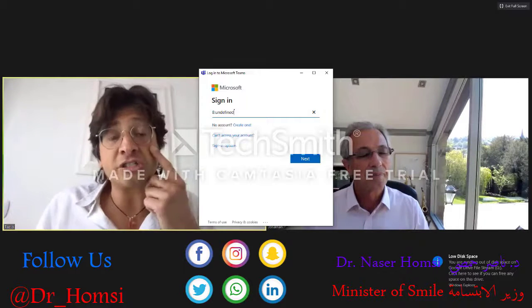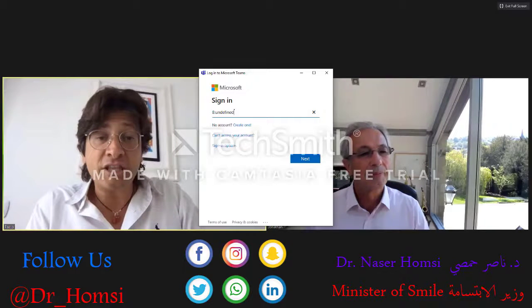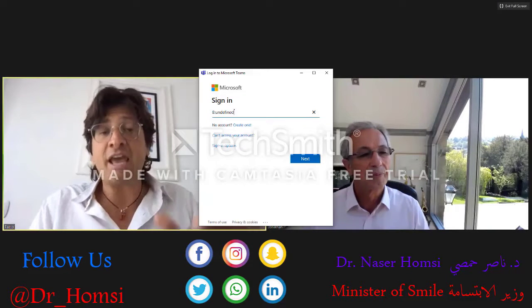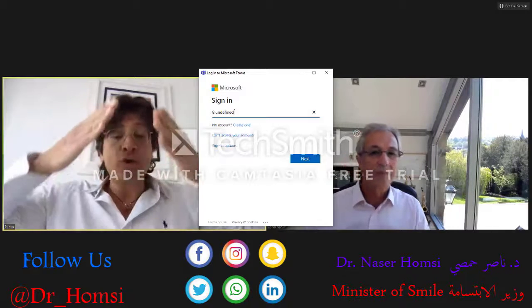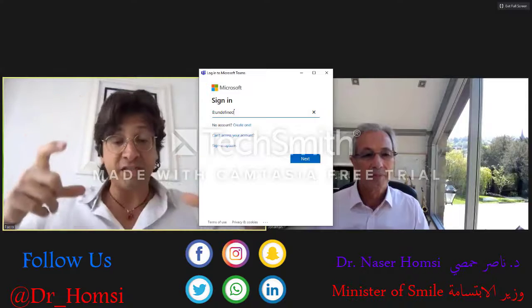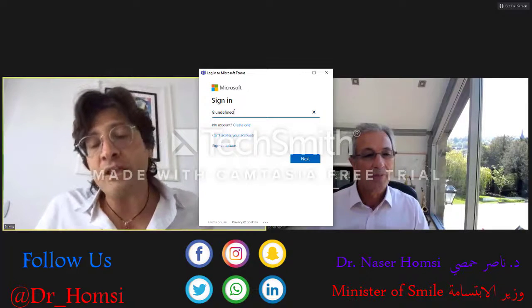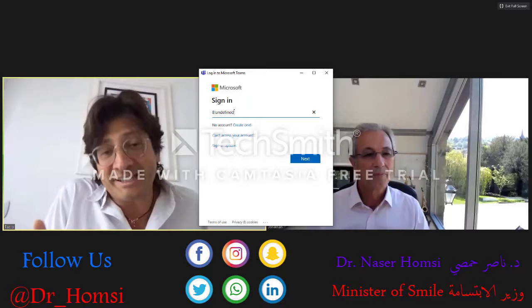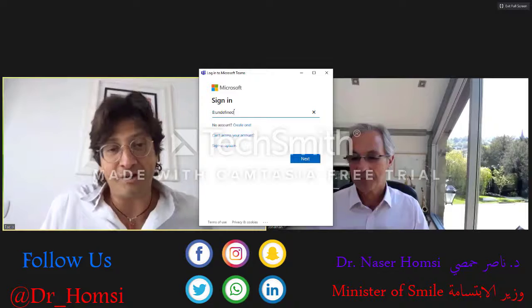But doctors can also measure on a paper printout of the scan, or on a picture if you have a very good 90 degree angulation with a stable stand, taking the picture at 1 to 1. Or they can do it on a cast, or sometimes even in the mouth, when the mouth is more complex, to be honest.